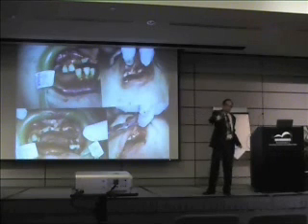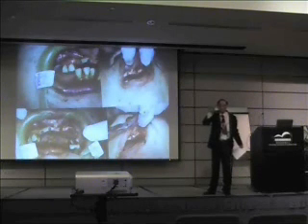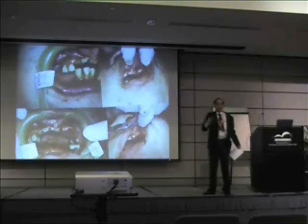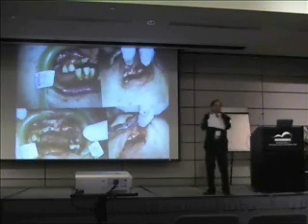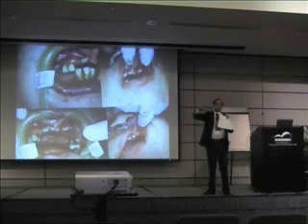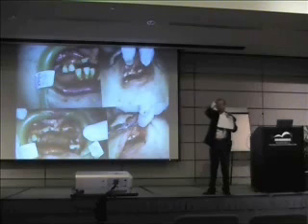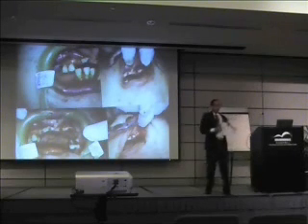use a scalpel and raise a flap. Raise a flap and see the bone yourself. And if the bone is really knife edge, take a diamond burr and shave off the piece of bone on top. So you get a flat top, which is at least 1.8 millimeter in thickness. At least 1. So that you can put in your diamond burr there and make a pilot hole. Remember that. So that is what you need to do.